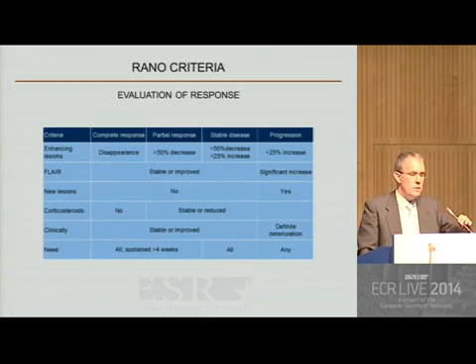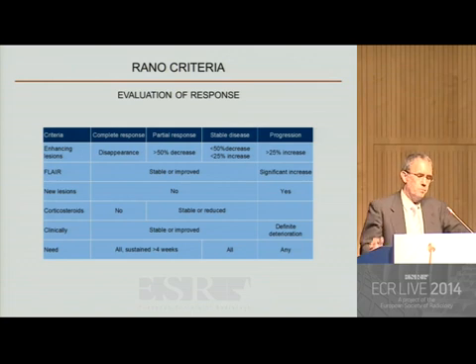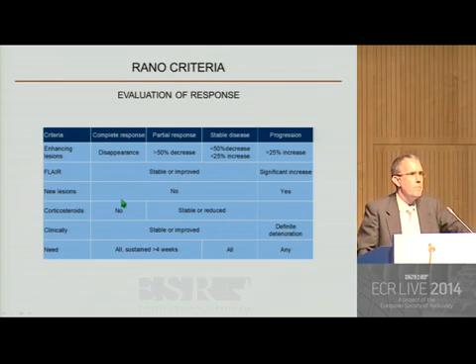With all these measurements, we have to evaluate response, and we have 4 possibilities: partial response, complete response, stable disease, or progression. To consider that we have a complete response, we need to fulfill all these criteria, and these criteria must be sustained for at least 4 weeks.